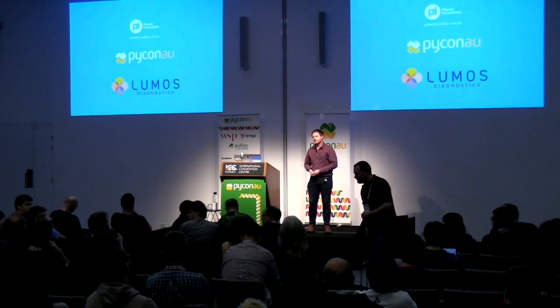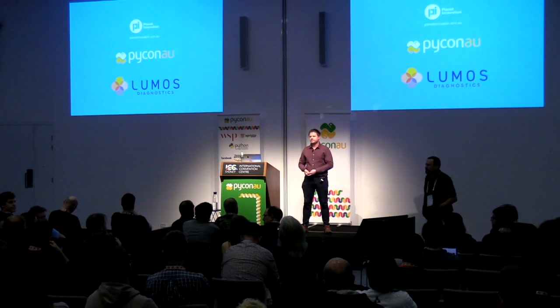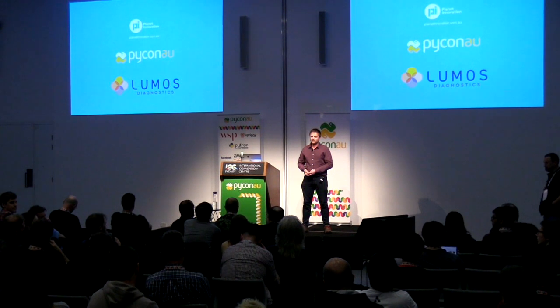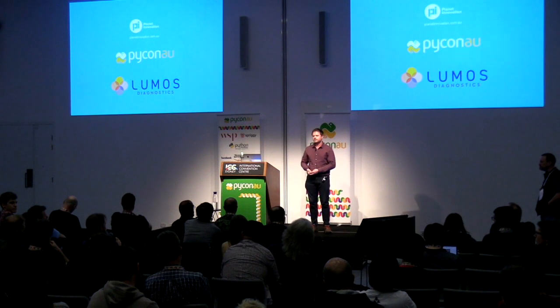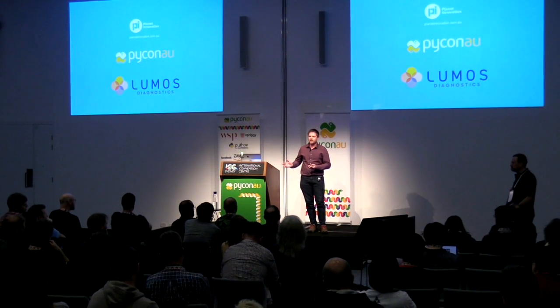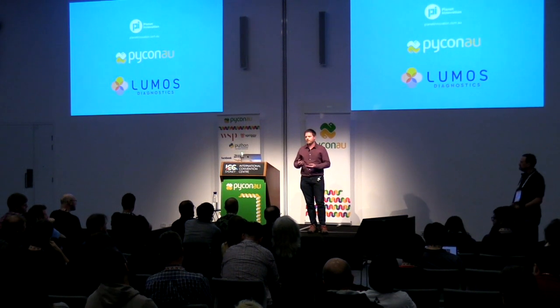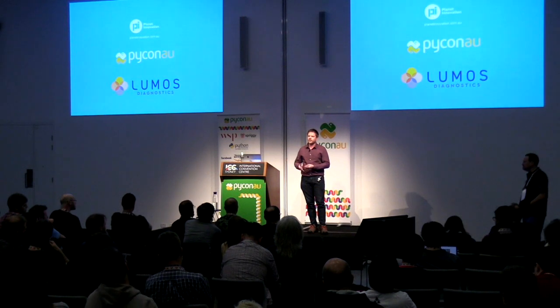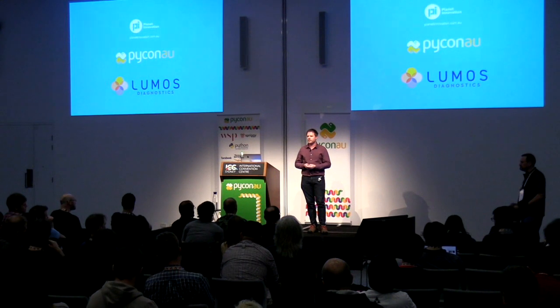Thank you. Great presentation. Just on that subject of security, is it possible to upgrade the software, say through Bluetooth, from the end user if you've got the app or something like that? The implementation we've got, I believe not, especially because the Bluetooth is on a separate chip altogether. So it's very much in a sandboxed environment. And even if you lock up that chip, that can't affect the main processor that's handling all the actual medical diagnostic work.